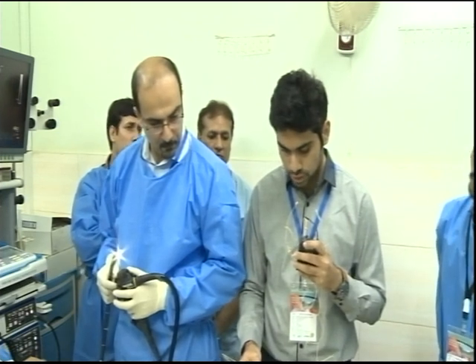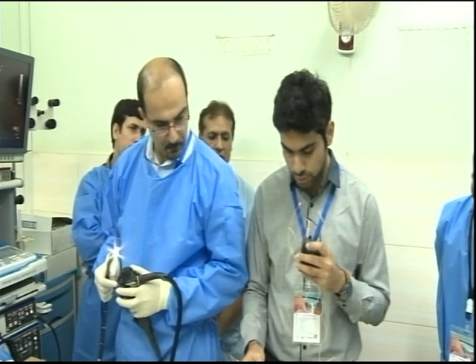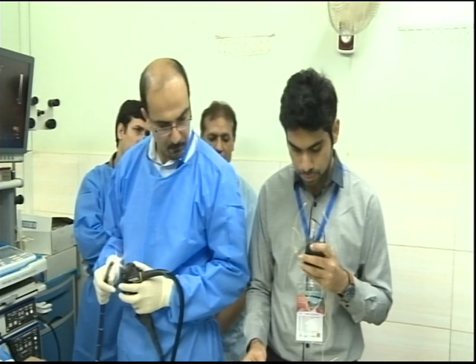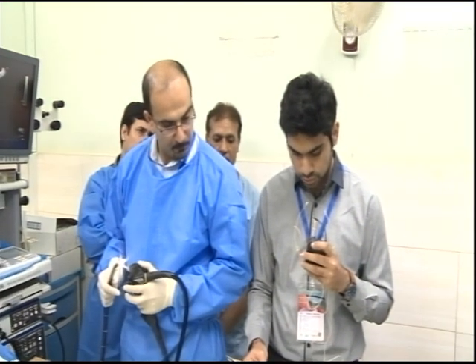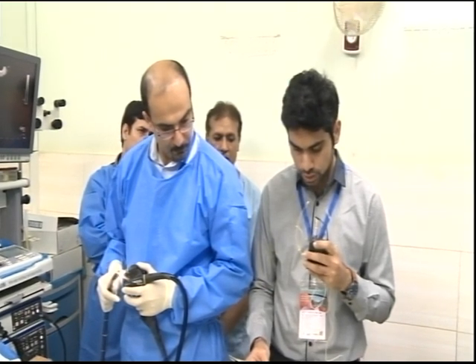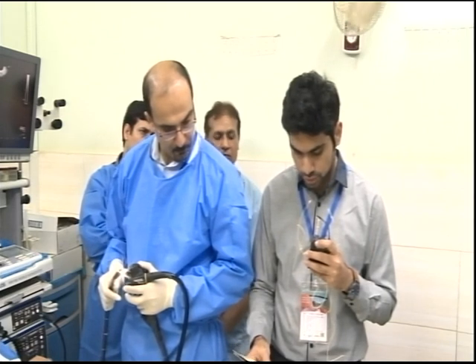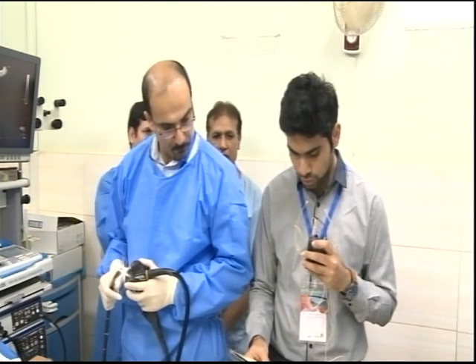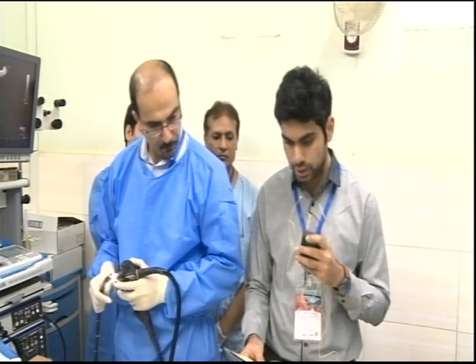There are also subcentimetric peripancreatic and retroperitoneal lymph nodes identified, the largest one 8.6 mm. His EUS done on February 18th this year shows a grossly dilated pancreatic duct of 22 mm and inflamed necrotic body of pancreas, and a mural nodule seen in the pancreatic duct. Atrophic tail and normal CBD, and features are suggestive of chronic pancreatitis.